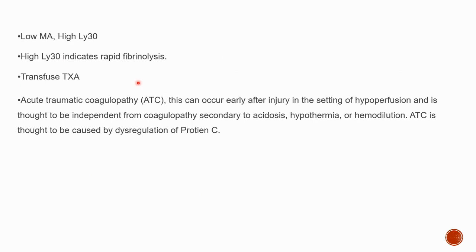This is a case of acute traumatic coagulopathy, which can occur early after injury in the setting of hypoperfusion, and it is thought to be independent from coagulopathy that is secondary to acidosis, hypothermia, or hemodilution, and it is thought to be caused by dysregulation of protein C.